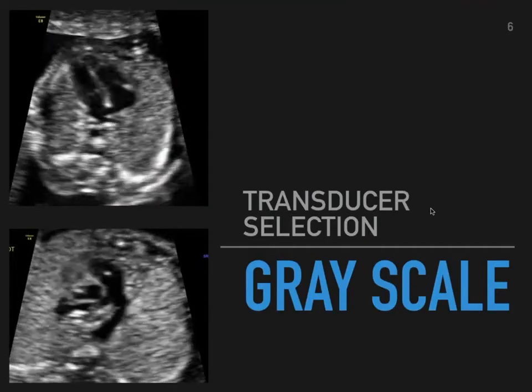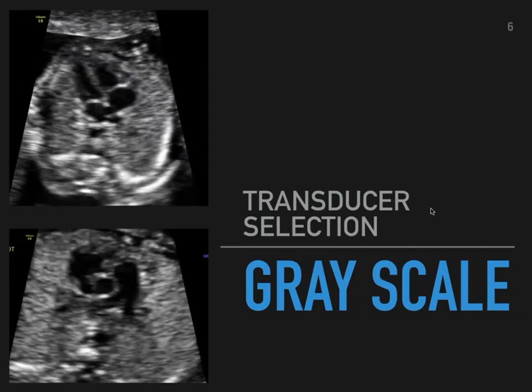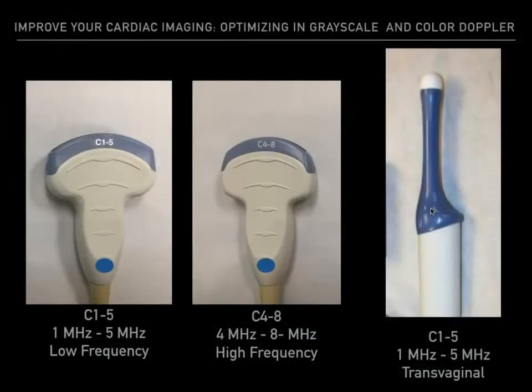In this first section, we'll discuss transducer selection in Grayscale. Frequency selection is dependent on the type of ultrasound transducer you would like to use. Here are a few of the different types of transducers utilized at our units. All have different operating frequencies that you could actually see at the tip of your probe or at the base of the plug, and all have different capabilities.